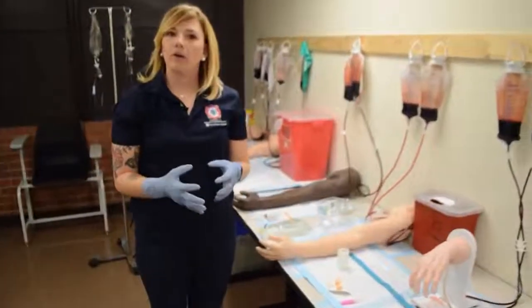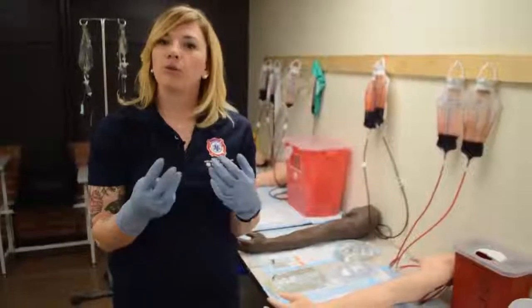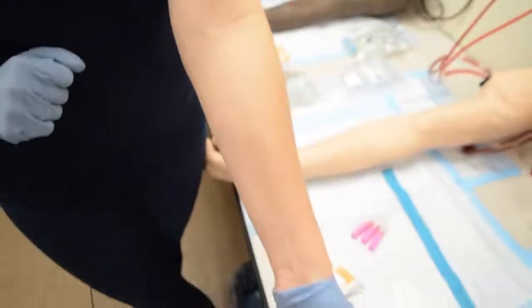So we also want to talk about the ways that you can find a vein, ways that you can feel a vein. There are 3 ways that are the best, that are the most beneficial. The 3 types of veins that we're looking for when we're trying to find an appropriate spot are ranked in order. The first type are ones that we can not only see, but we can also feel. And by feel, I mean when you cross over a vein, there is a soft squish or bounce that you can feel. Try and use your most sensitive finger and use that finger every single time. So our first choice would be one that we can see and feel.